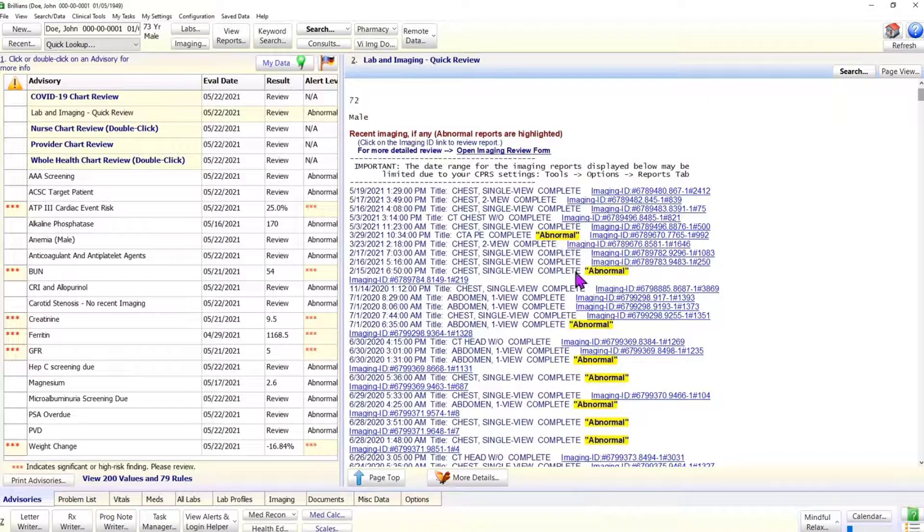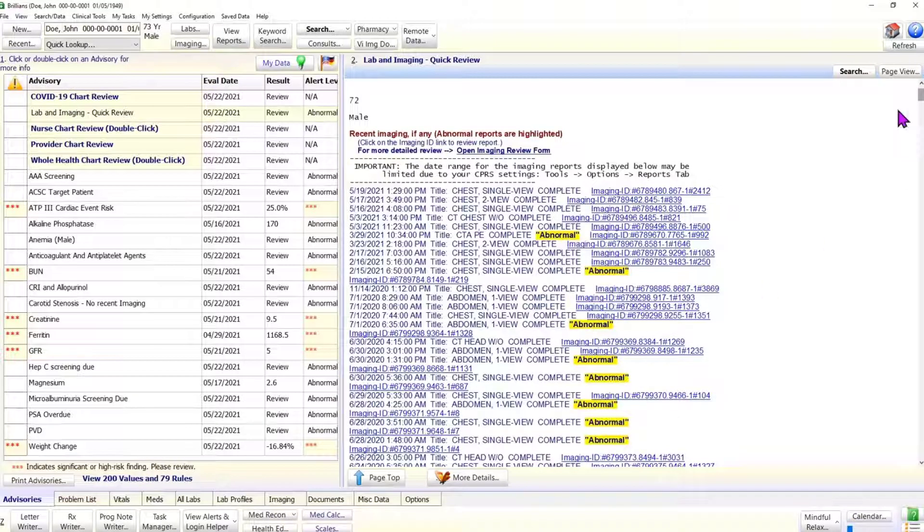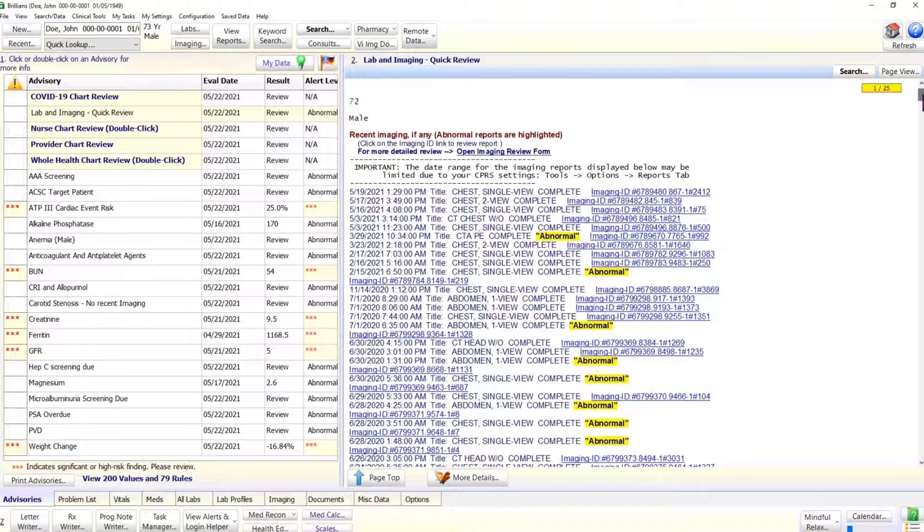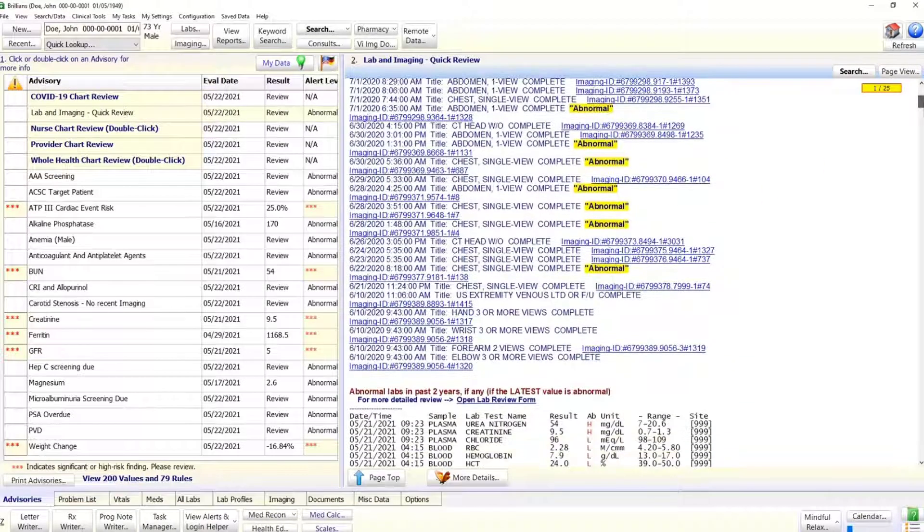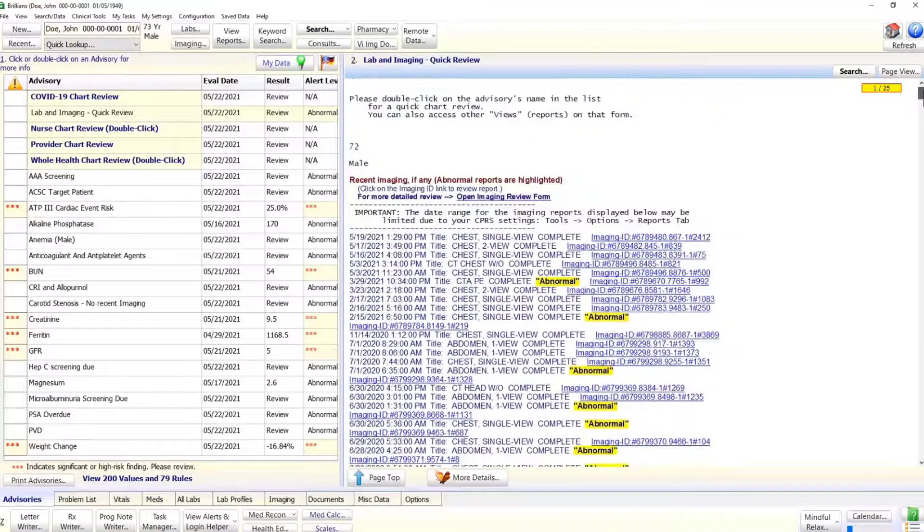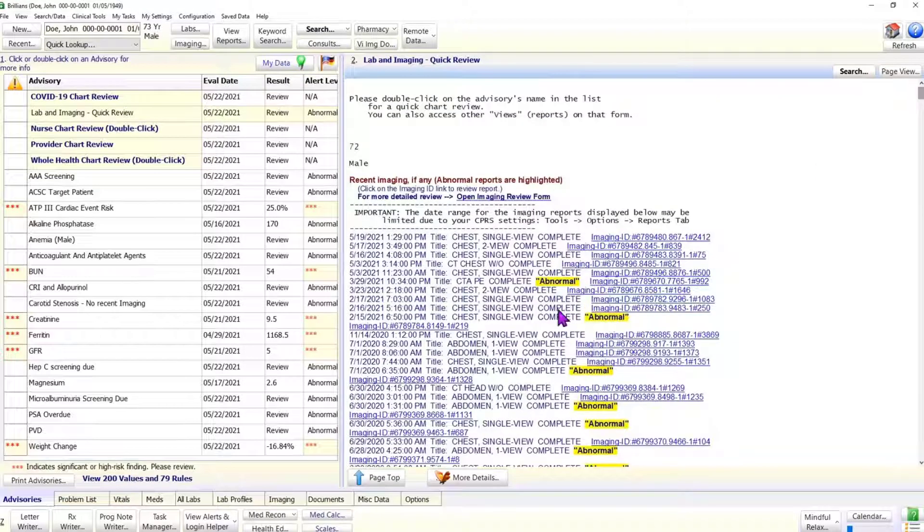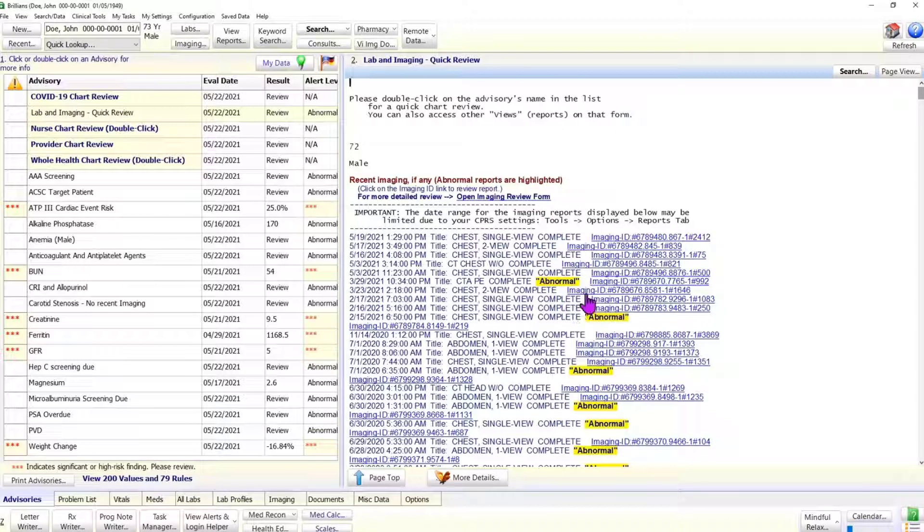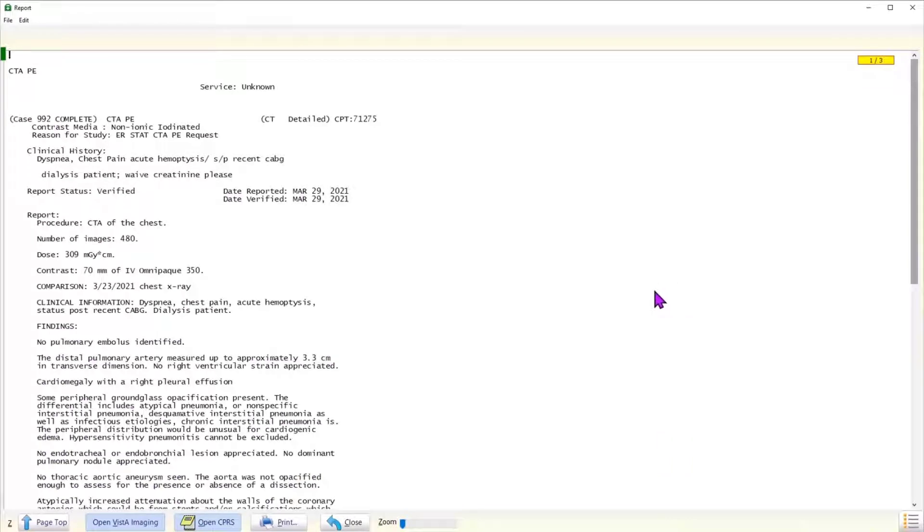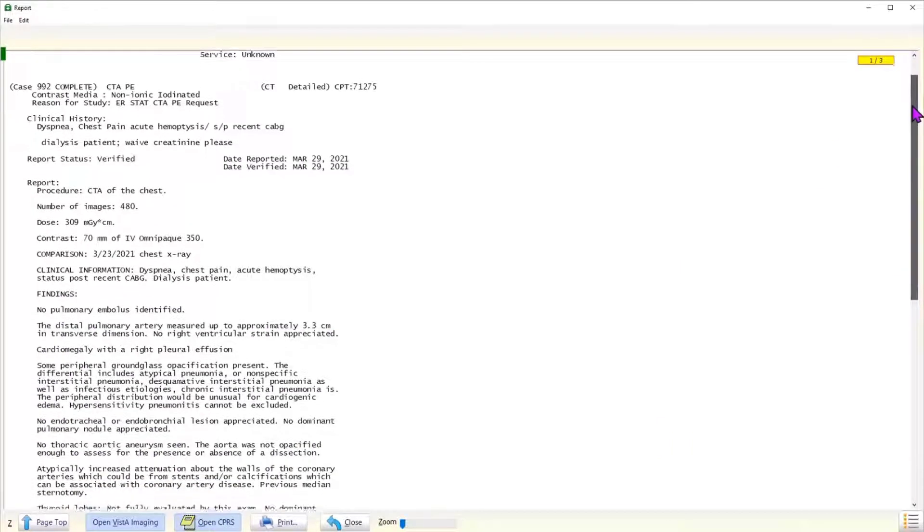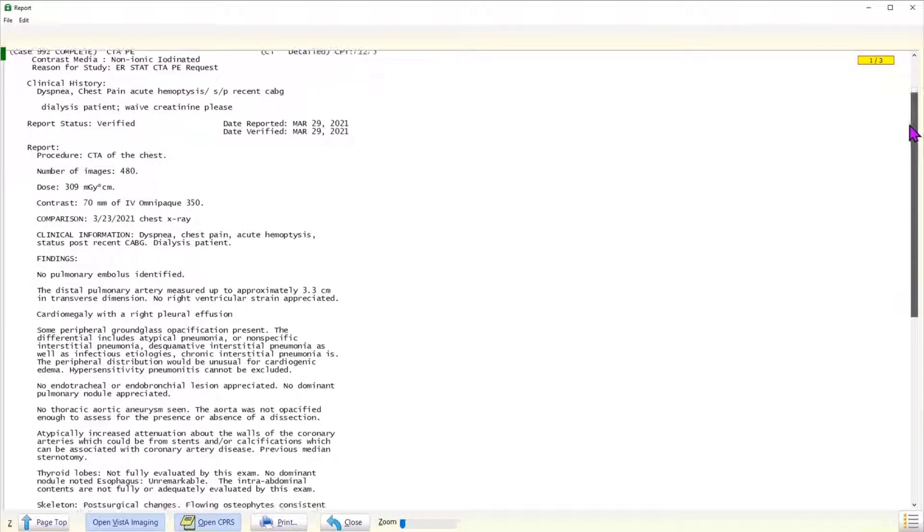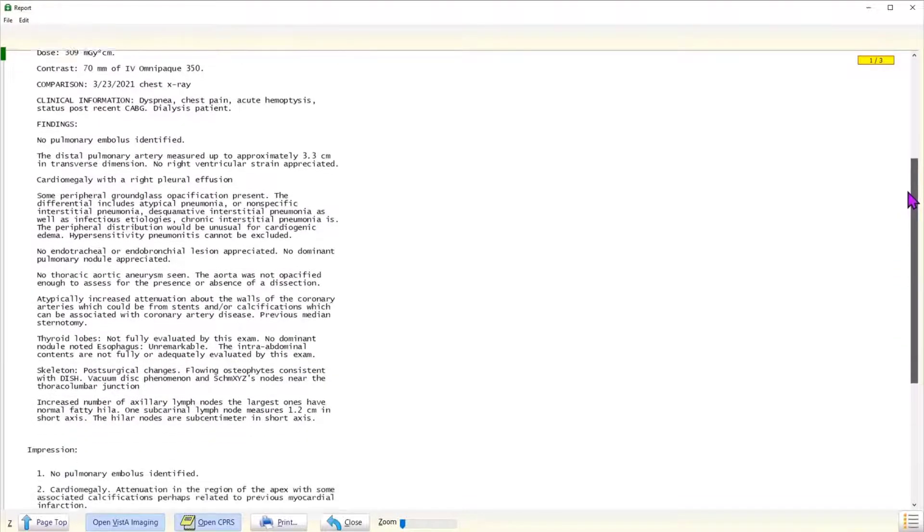We can scroll down and see how many abnormal reports are there. This visual flag greatly reduced the risk of missing an abnormal report. To review the desired report, click on the imaging ID link next to the report's title. The selected report is displayed in a separate window. Please review the report, then close down this window to return to the advisories page.